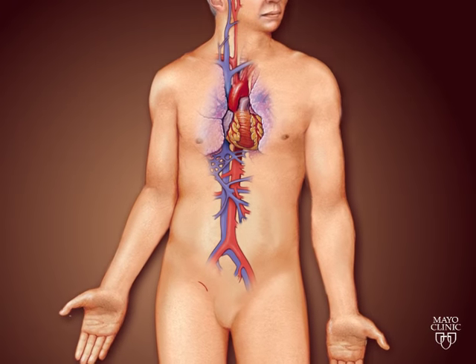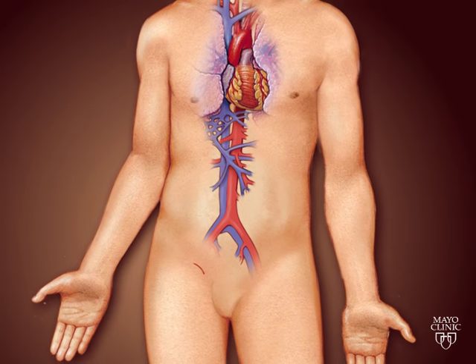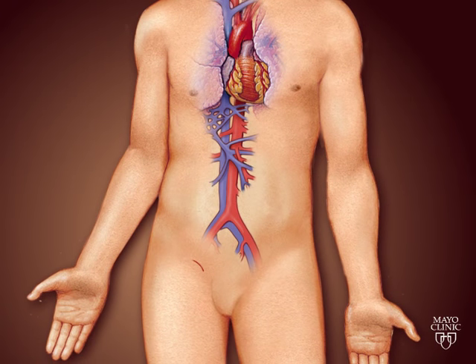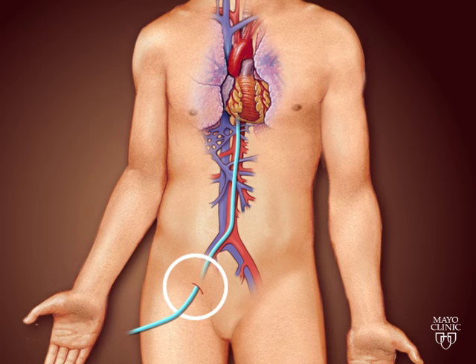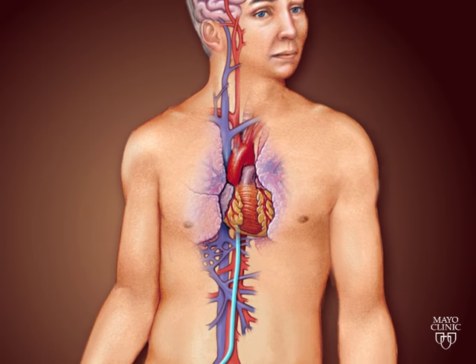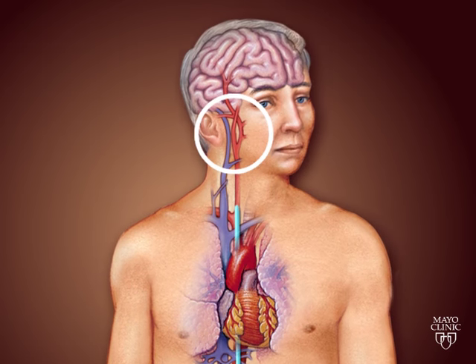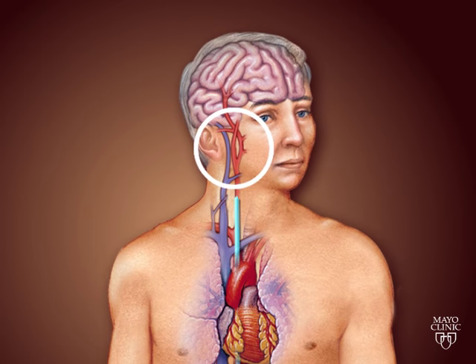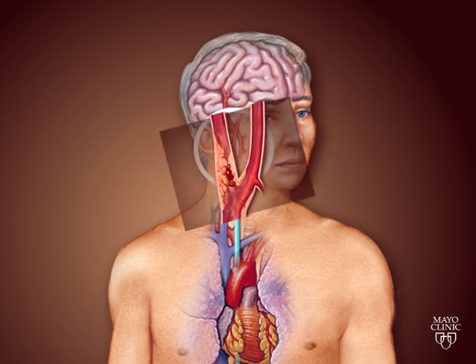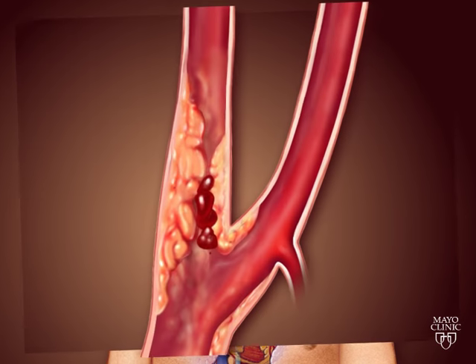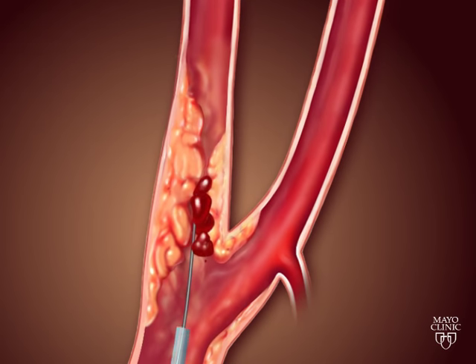In carotid angioplasty and stenting, a long, hollow tube called a catheter is inserted in the femoral artery in the groin area. The catheter is then maneuvered through the arteries until it reaches the narrowing in the carotid artery in the neck.